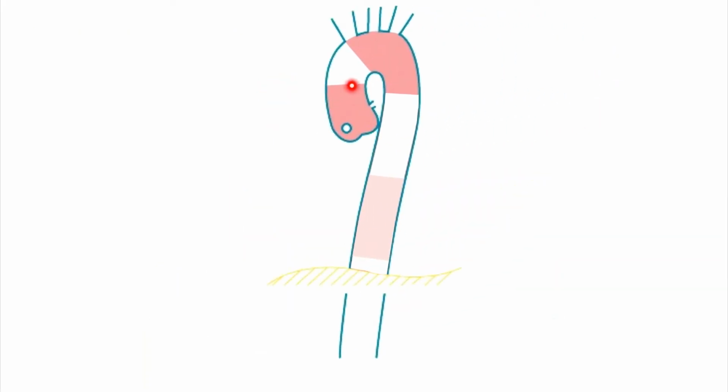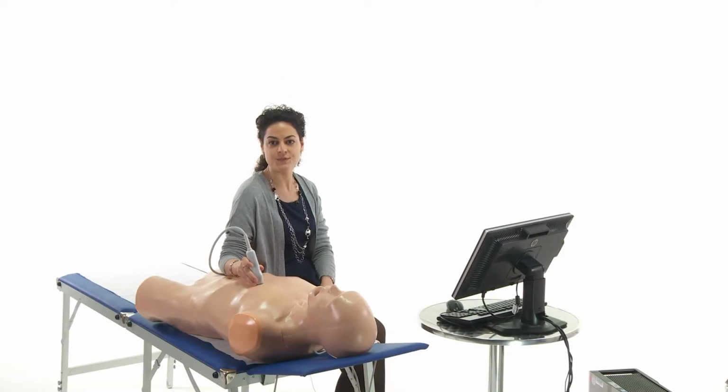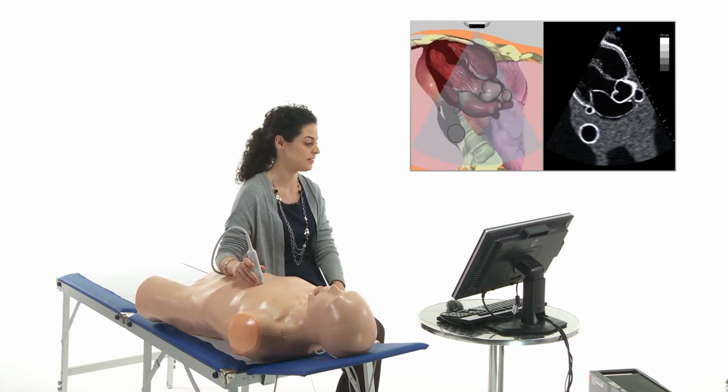We can really well visualize the ascending aorta and the root. We can see the arch, and we can even see parts of the descending aorta. But I guess this is easier to understand when we go to the simulator. The aorta leaves the heart in a really strange fashion, and the simulator is optimal to show us this.